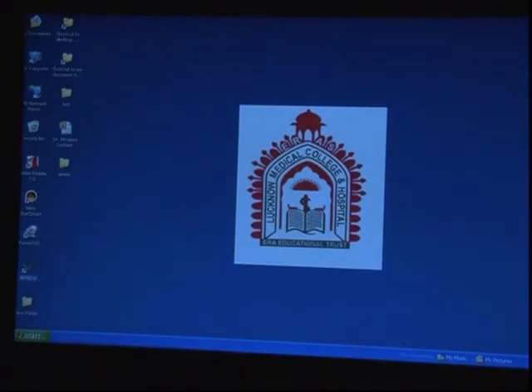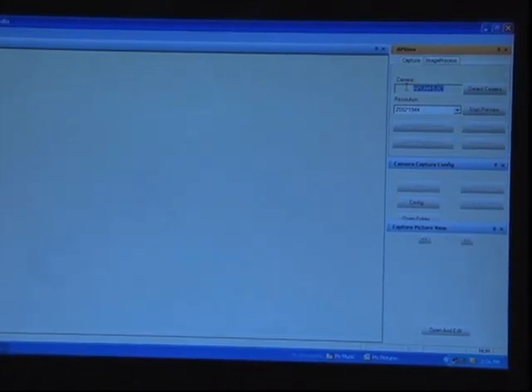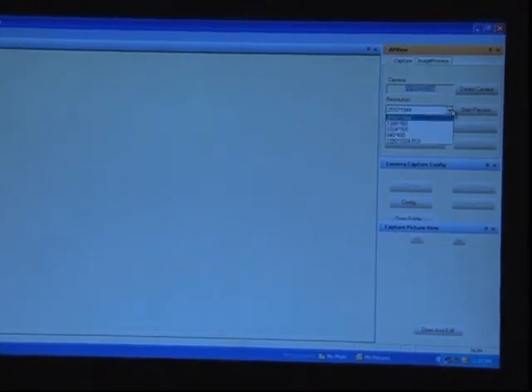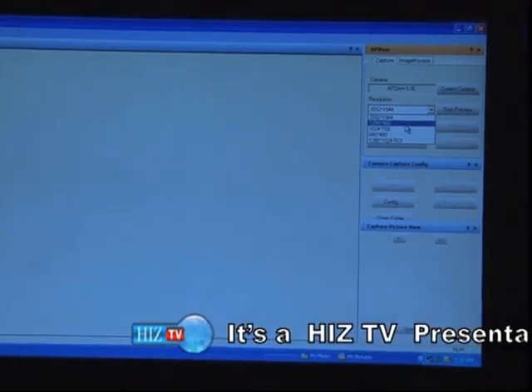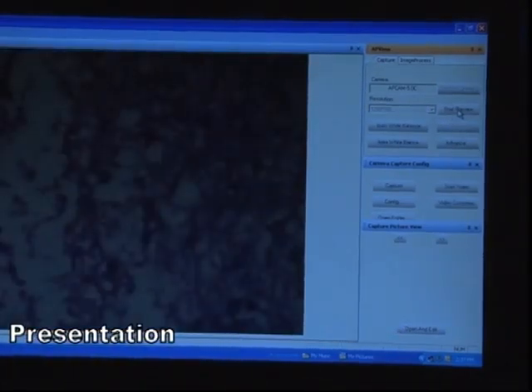After installing the software, we click on the AP View folder and then click 'Detect Camera.' This shows 'AP Cam 5.0c,' which means we have a 5 megapixel camera installed in the microscope. Next, we set the pixel resolution, which is normally set to 1280 by 960. Now we start the preview. The auto white balance option is usually used when the slide is changed for color matching of the base color.